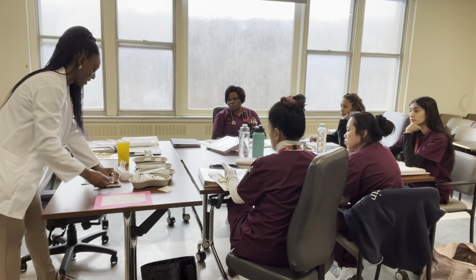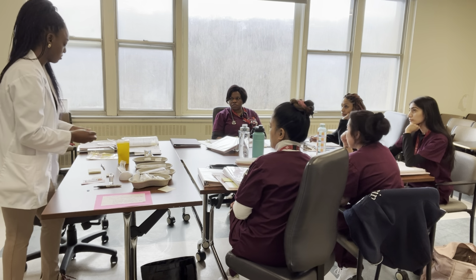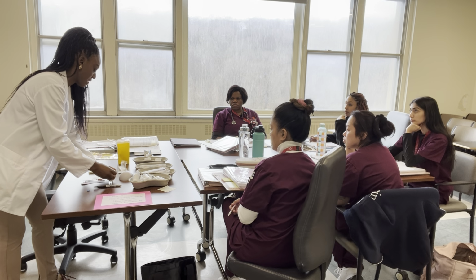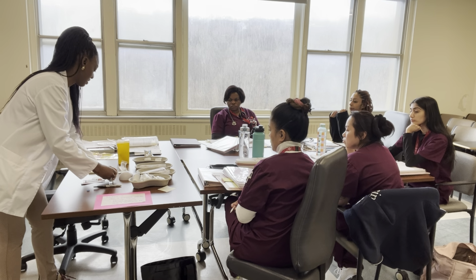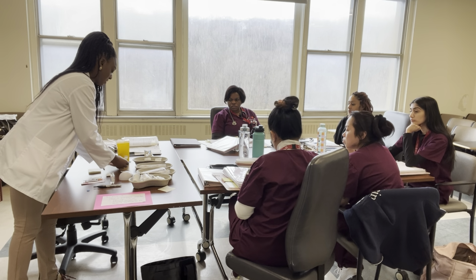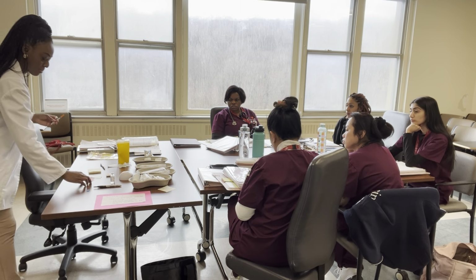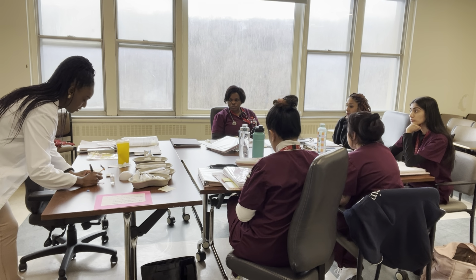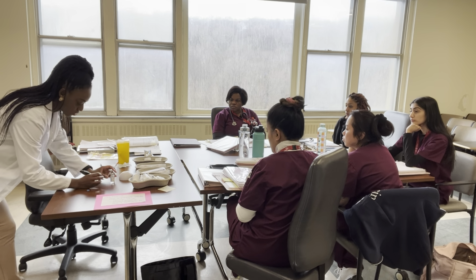I'm going to ask you, when I remove the cap, do I have to do anything? Do I have to clean it? Yes. You're saying no? I would say no because it's brand new, but if it was used, I would clean it. So the answer is yes, because it's just a dust cap. It doesn't mean it's sterilized. Okay? Alcohol is what we use to sterilize it. So then we clean it. While we're cleaning it, I know how many I'm going to pull up because I wrote on the card on the patient's identification information, Humalog, and I put the 5 units that we came up with, and then I'm putting the expiration date, which we said was 2026.